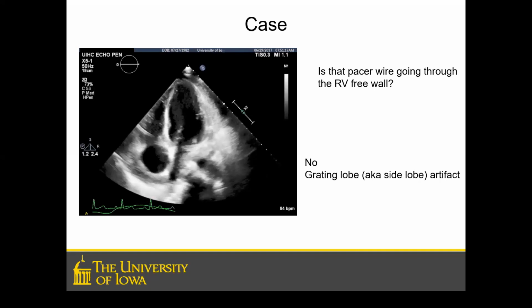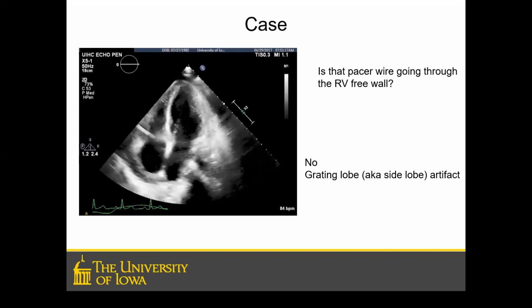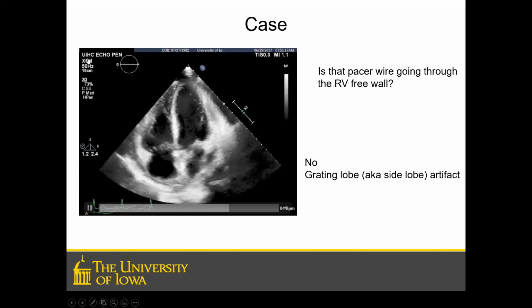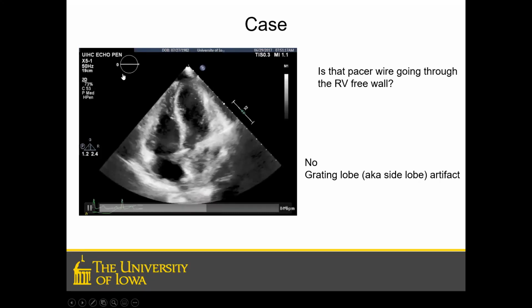So if we really can't get through the subcostal, we might go out of harmonics, and then the image doesn't look very good, but at least you can see something. In addition to that, we are almost always using a matrix transducer, which usually says X something. This happens to be Philips.